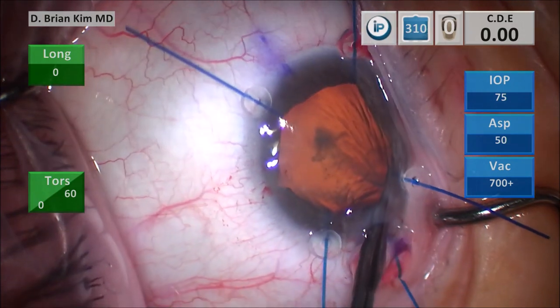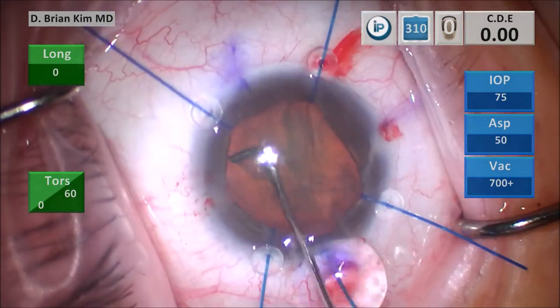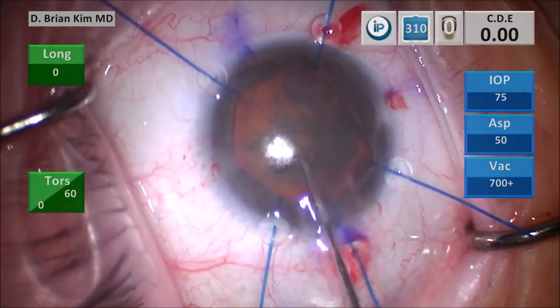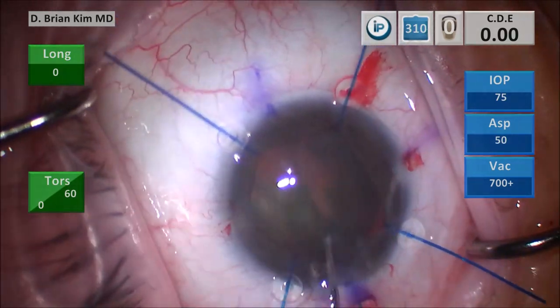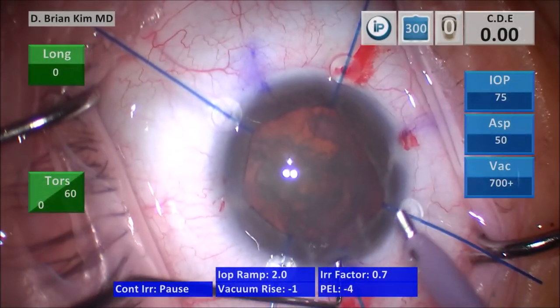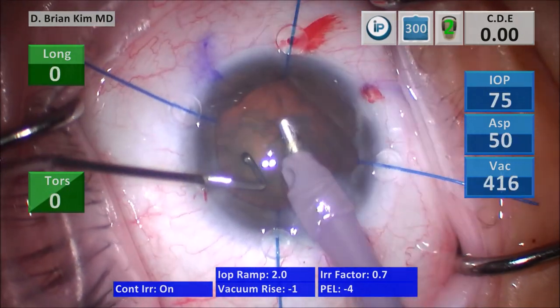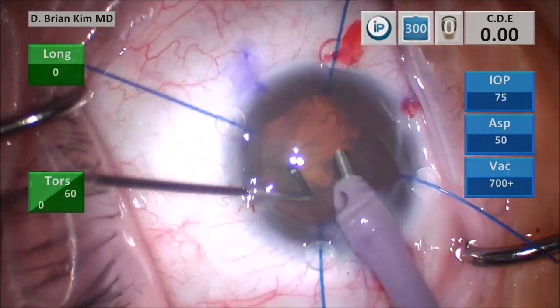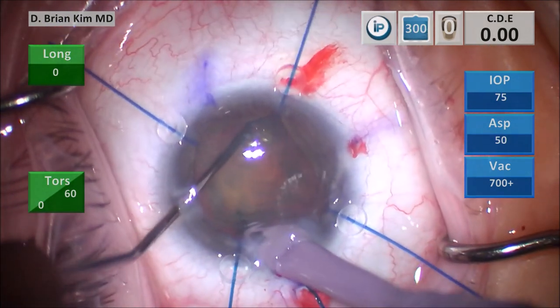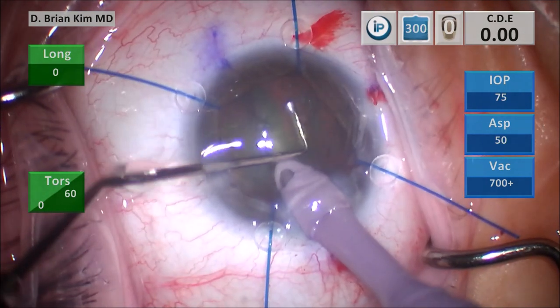I go ahead and burp the viscoelastic out and begin my capsular fornix hydrodissection technique. I place a cannula underneath the anterior capsular surface on the contralateral side, point it down, get a nice fluid wave, decompress to the left, and then begin to spin the lens — you can see it spins quite nicely. I lift the incision with the chopper, go in with irrigation off to minimize stress trauma, start to remove the surface epinuclear material, place the chopper out to the contralateral equator, turn the faco tip vertically, and crush and break the lens in half — this is the double chop maneuver.